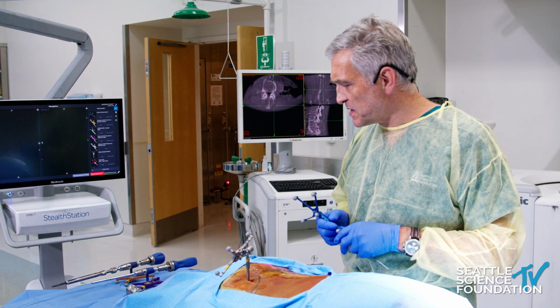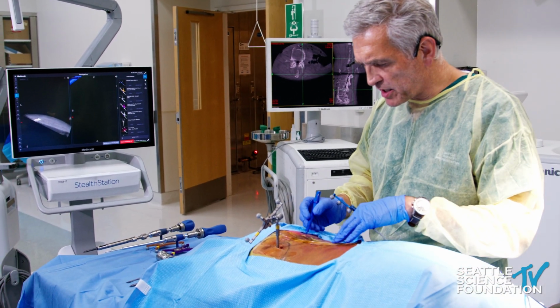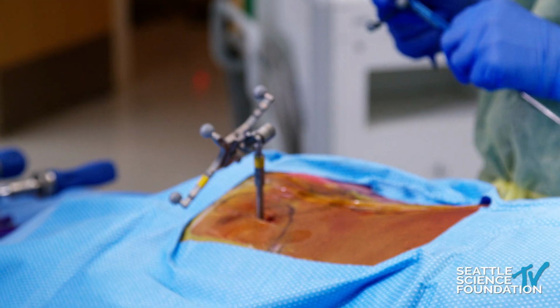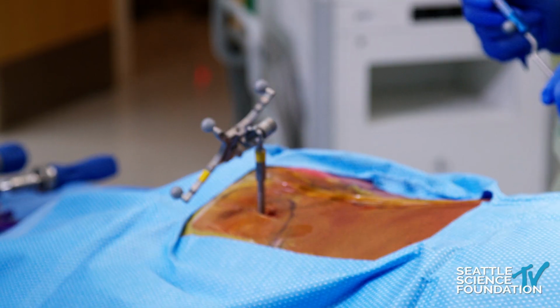Once I've done that, I mark the midline with a marking pen. I mark the iliac crest, and I put in my reference array on the other side, which is something that we did already, and we got a spin, of course, already as well.